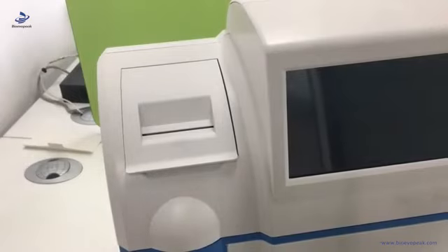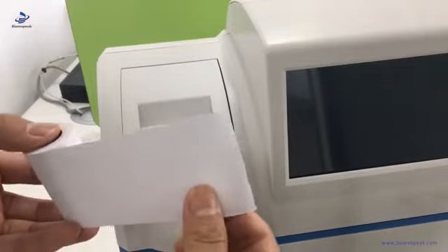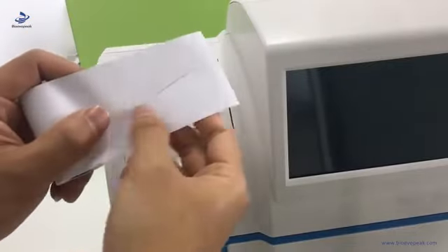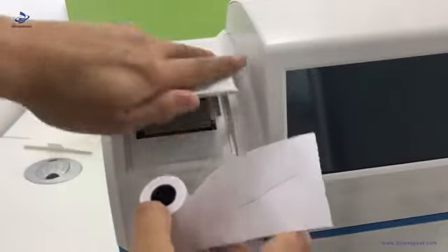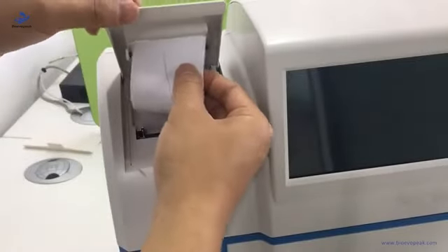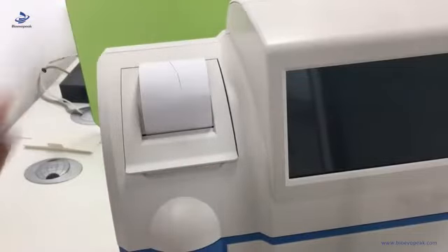Install the printer paper. Hold the paper and pull a piece out, then use your fingernail to scratch it. If there is a black line, it is the thermal side. Open the printer door, put the paper inside, let the paper go through the hole, then close it.